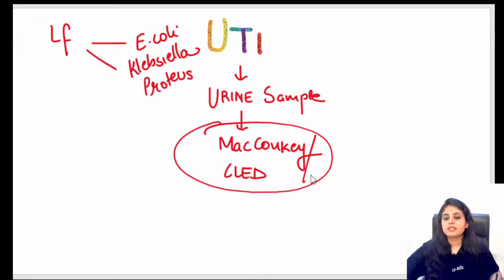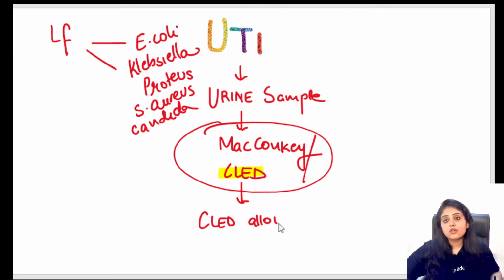Either of the two. But I'm saying CLED is better. Why? Because UTI also happens because of other organisms, no? Rarely UTI also happens because of Staph aureus. UTI can also happen because of Candida. There are rare causes also. Who supports the growth of rare organisms? Please remember, CLED allows other organisms also to grow.